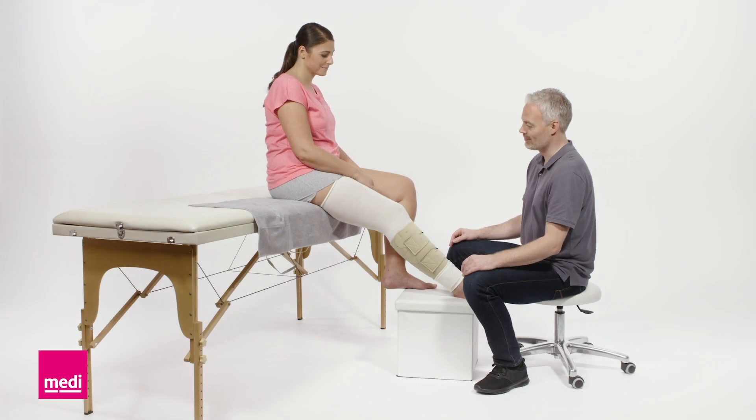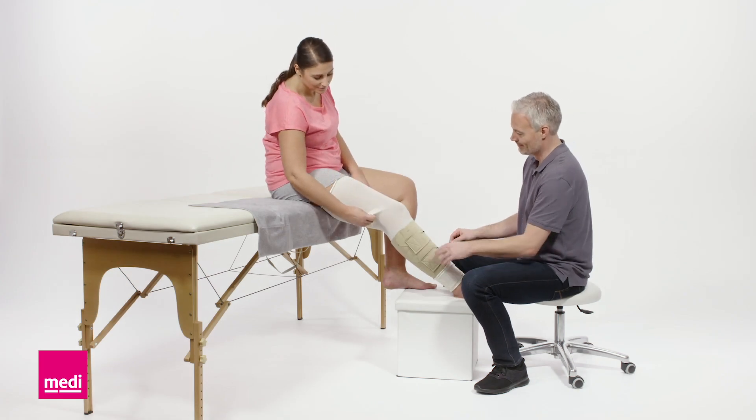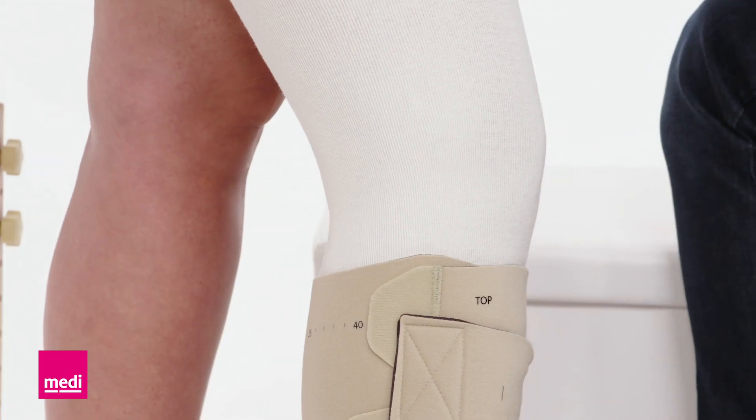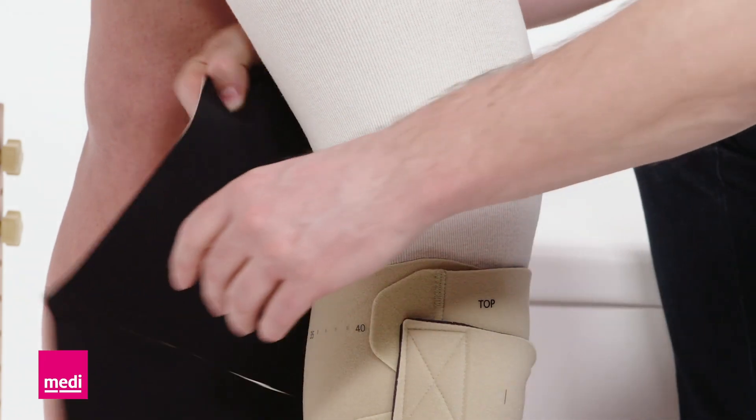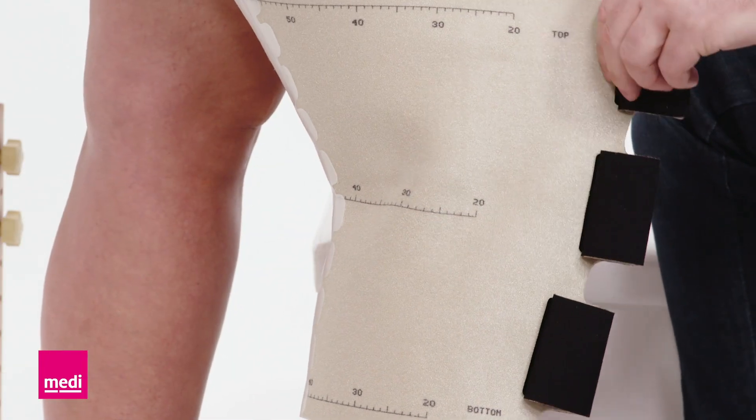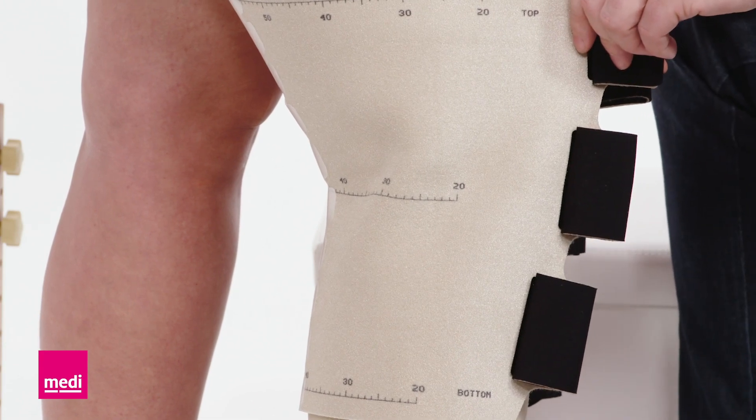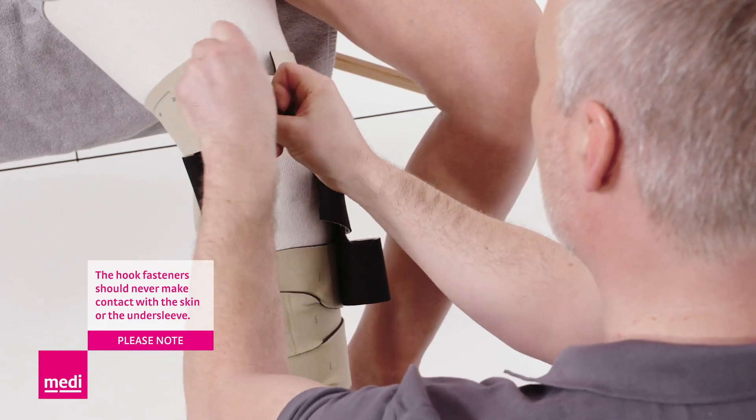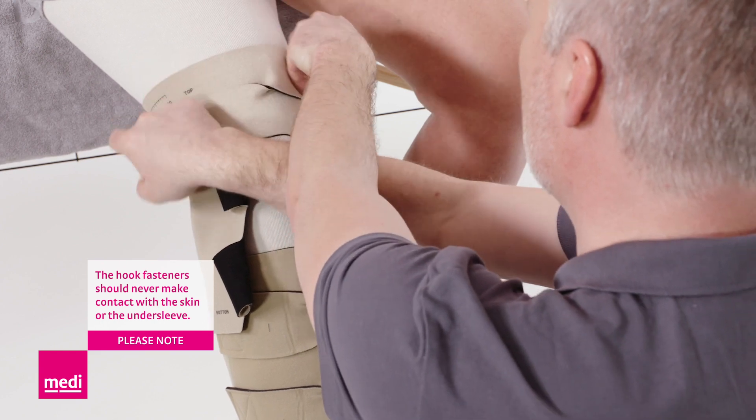Make sure there are no wrinkles in the undersleeve. Align the knee component in the knee crease at the height of the medial numbers. Attach the top two bands loosely to hold the garment in place.